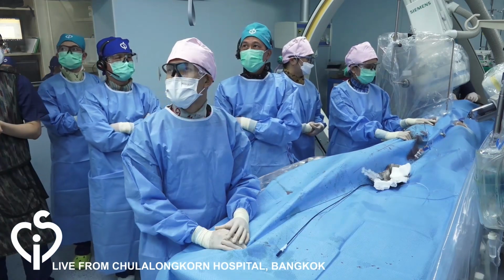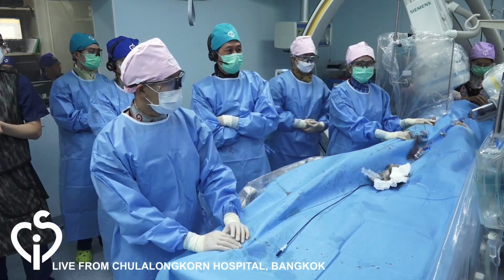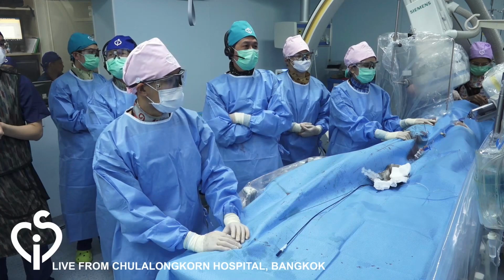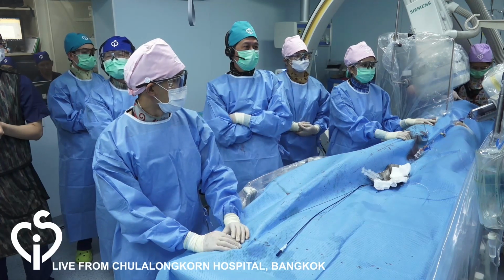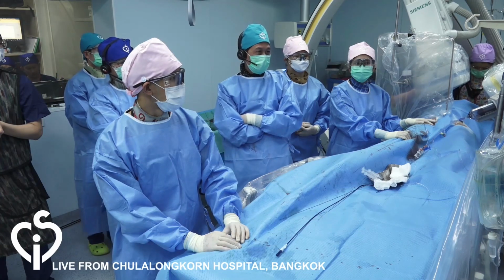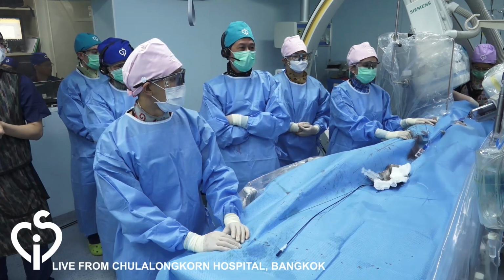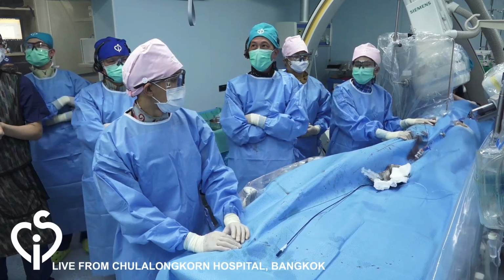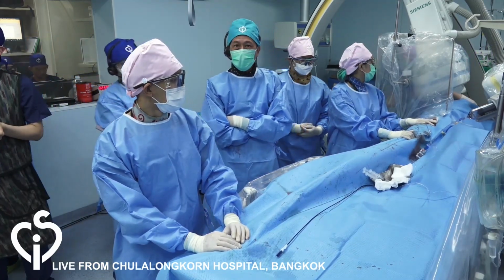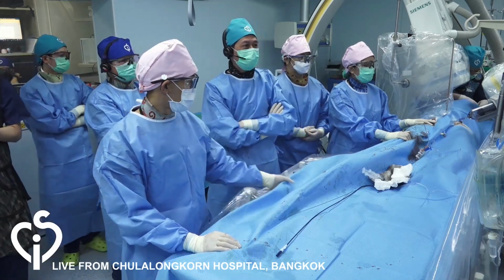The reason I ask is that if we try and block the exit, my concern is that we may leave behind a cul-de-sac, which over a period of time could increase in size, and then you have issues of thrombus formation, coronary embolization, and so on and so forth. So that's the area we need to see more on live TOE, and that's where we need to make measurements, because I would try and close it at the entry rather than at the exit. Okay, Nageshwar?